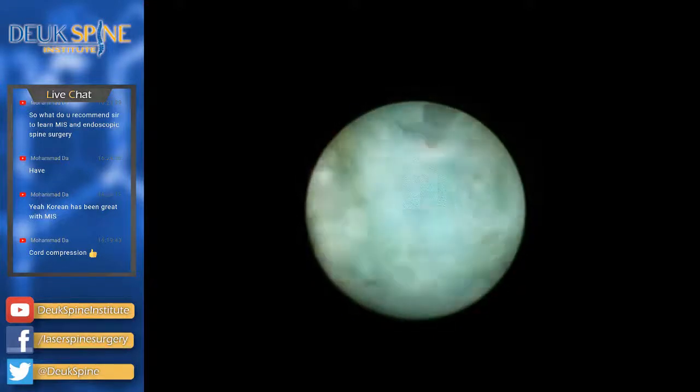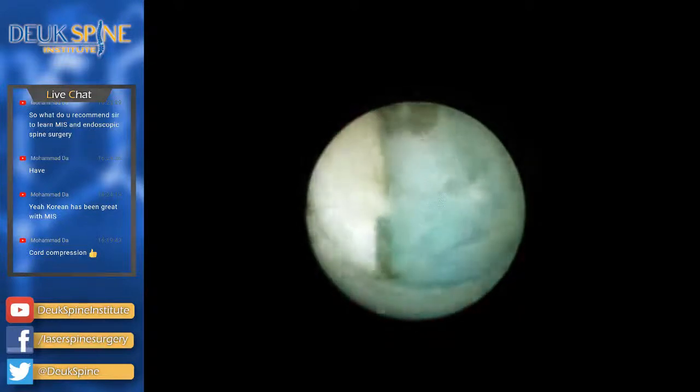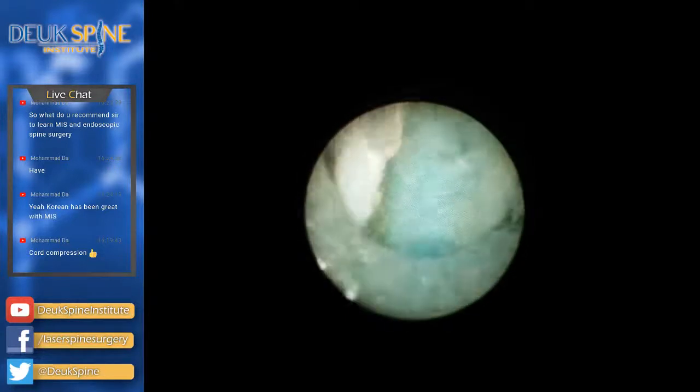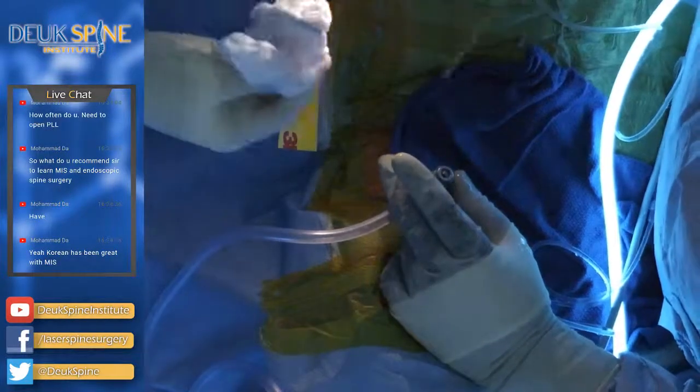There it is right there. See it? I'm not zapping because it's right on the spinal cord. But that's what needs to come out right there. That's the herniation sitting on the spinal cord. That's the end plate of C5 and the end plate of C6. So I'm going to try to grab it out by using some little grabbers that are long and skinny that go down the tube, and I can feel it, and I'm trying to pull it out.